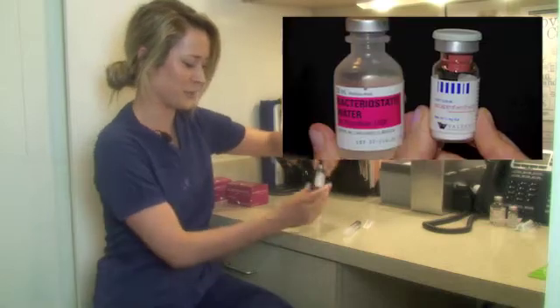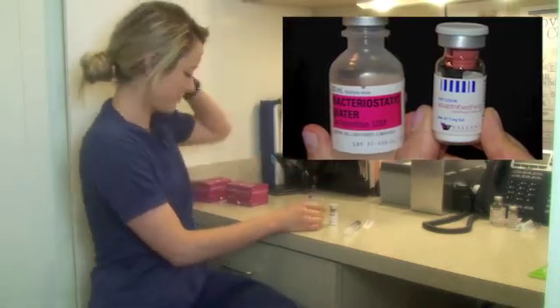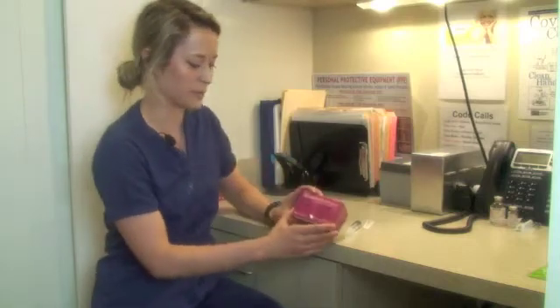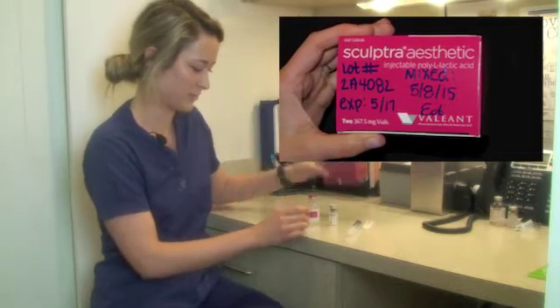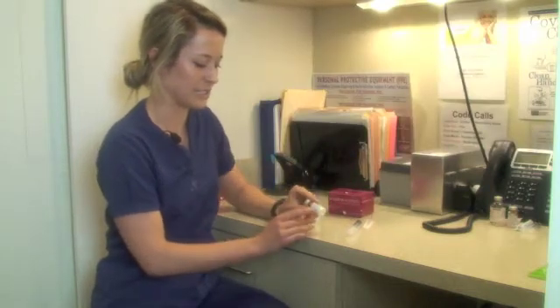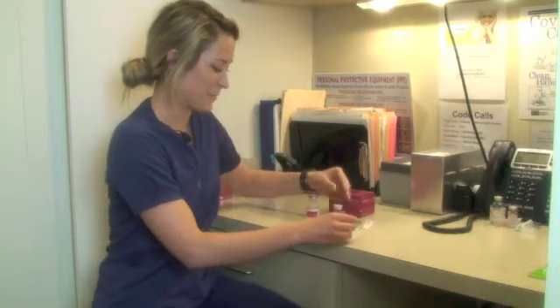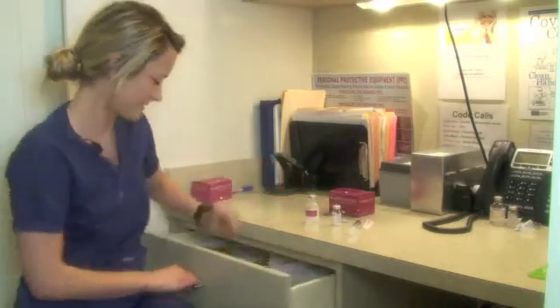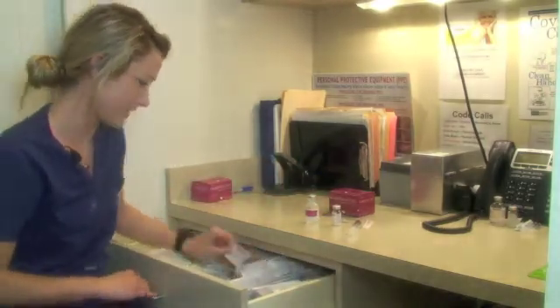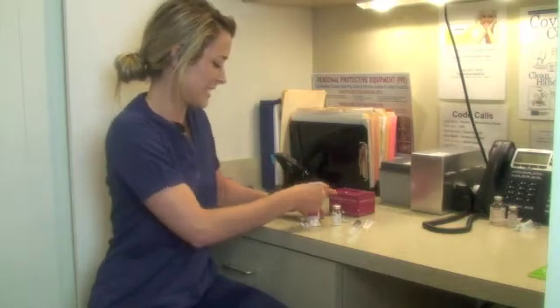To start, we're going to take our Sculptra vial, and we're going to use some sterile water. Before we mix, we always write our lot number, the expiration date for the product, and the date that we mixed it with our initials. So we'll also write the date that was mixed on the vial. What we'll do first is we're going to take our caps off and sanitize both of them.